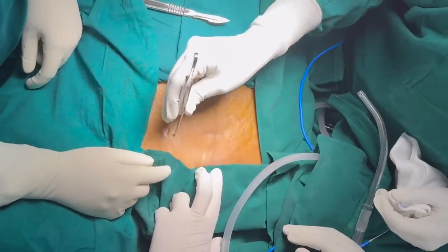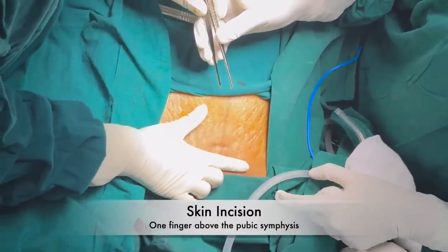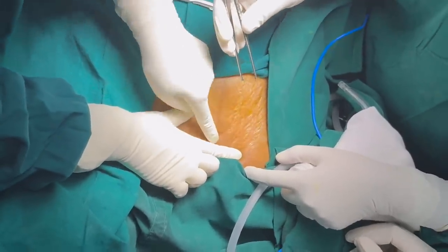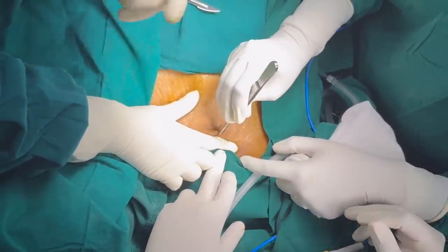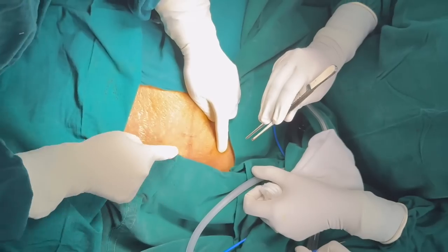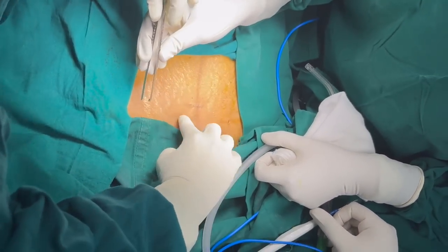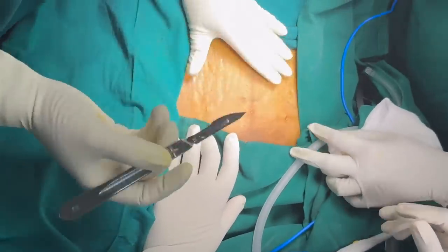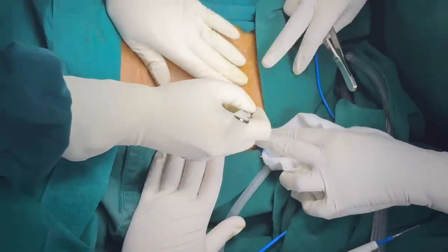Well, begin is half done, they say. So planning your first incision plays a great role. For abdominal hysterectomy, the incision should be placed one fingerbreadth above the pubic symphysis, unlike cesarean where you go two fingers above the symphysis. In cesarean, we just have to reach the UV fold, while in hysterectomy, the aim is to go below the lower margin of cervix. Always start with a small incision — during surgery, if you feel any movement, you have an option to increase it. But if your incision is big and later you want to decrease it, there is no way to do it.